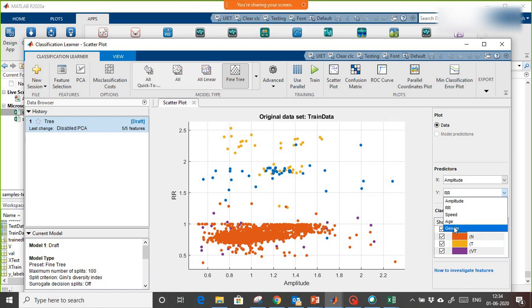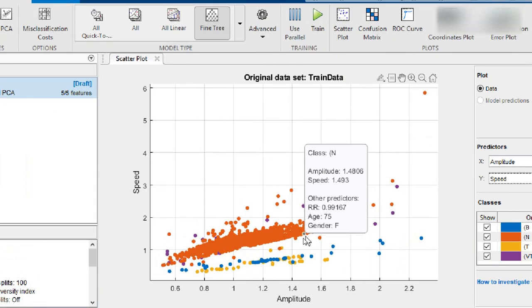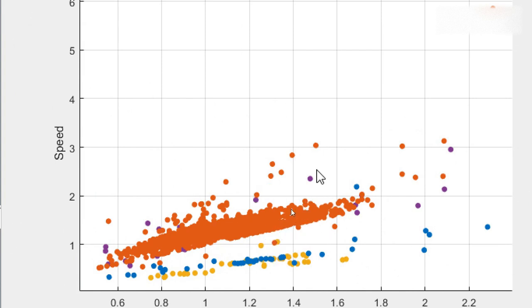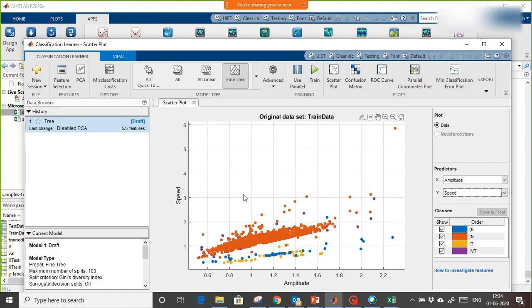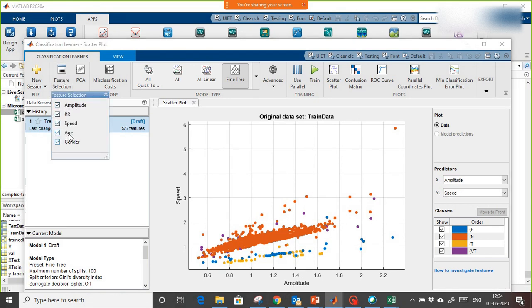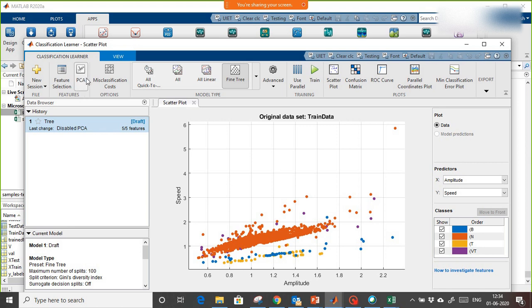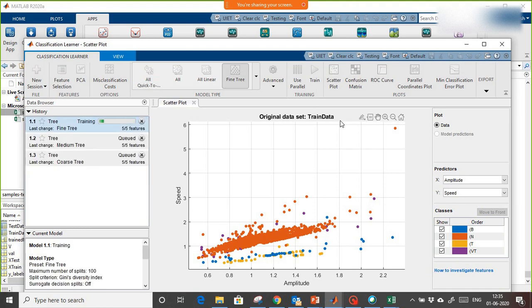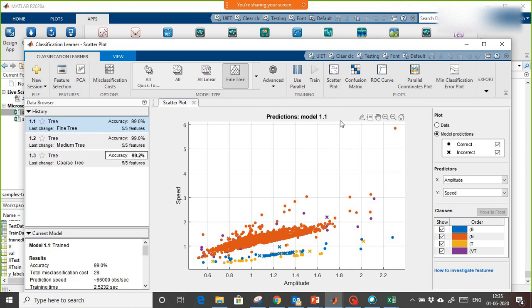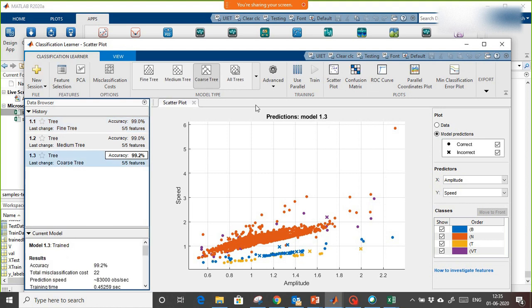When training, features should not be correlated with each other. If the classes are well-separated, that is good. If any feature is redundant, you can deselect it. You can also apply PCA to reduce feature dimensions. Then clicking 'Train All' trains three algorithms, and the best accuracy achieved is 99.2 percent.